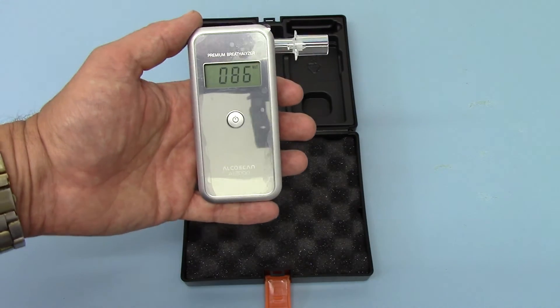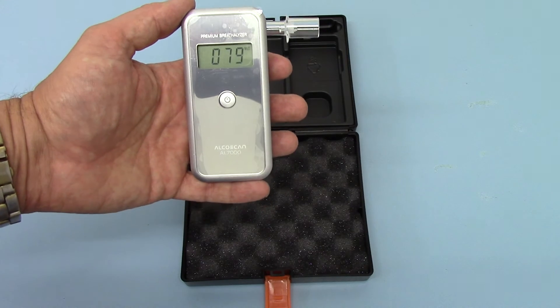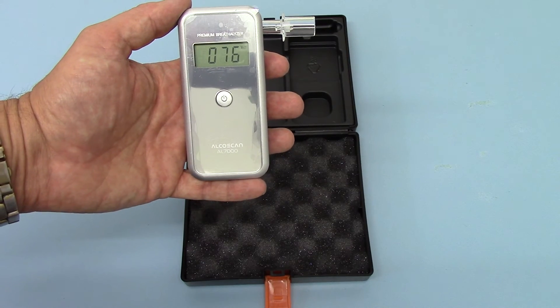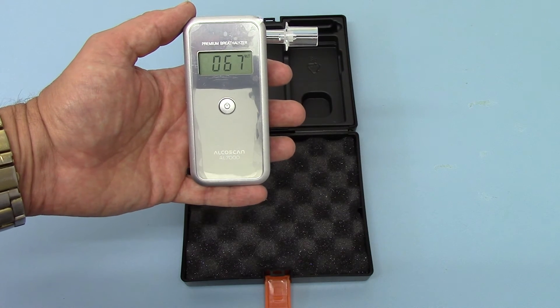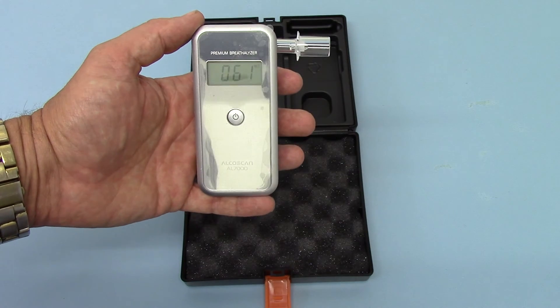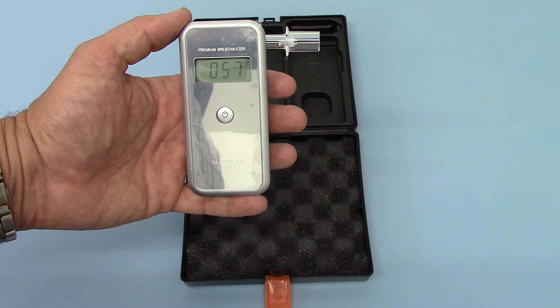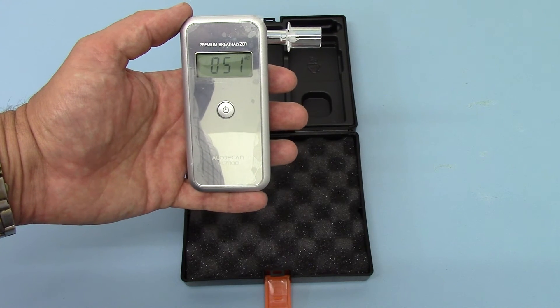You'll see that the speed of the countdown slows considerably just below 100 — that's quite normal depending on the ambient room temperature you're operating at. You will get quite a variation; it may suddenly speed up again. When it's ready for the breath to be put through, you'll get a single beep. Just watch as it counts down and listen for the tone indicating the breathalyzer is ready.